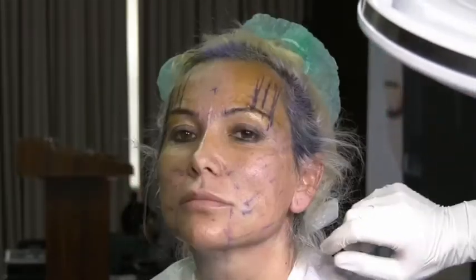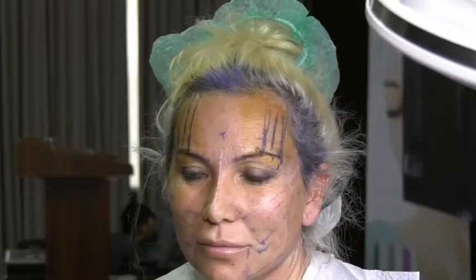We will do now the eyebrow. Okay, that's an easy case, but we will have more difficulties. Oh look, but the patient looks what? Younger. This is the only word that will come to my mind when I see the patient if I didn't attend this session. When she goes out of the room, I am her friend, I will see her, I will say one word. You look younger. I don't know what she did, but she looks young.